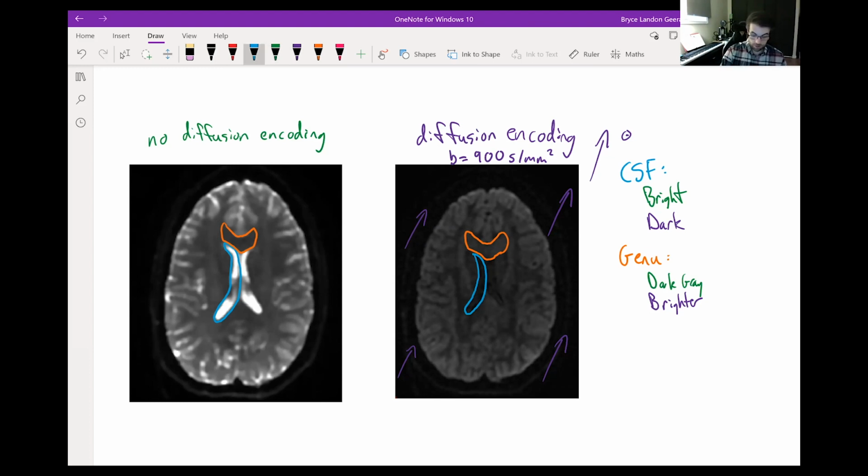And then finally, if we look at the tract that's connecting back to the front of the brain, something like this, let's say it's the SLF. This is an area that's darker. I feel like I've drawn a little bit too close, so it's hard to see the difference. Let me just make that a little bit larger. You can see this kind of darker line in that circle that I've drawn surrounded by lighter gray tissue.